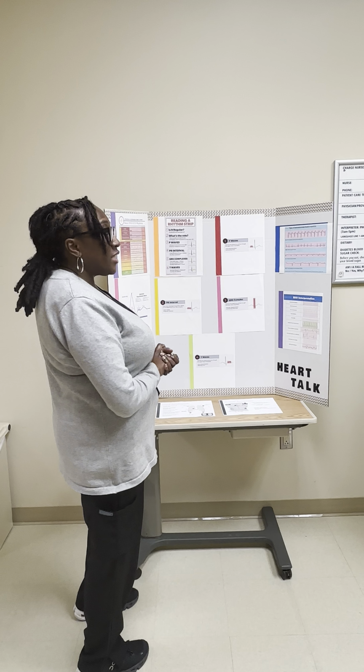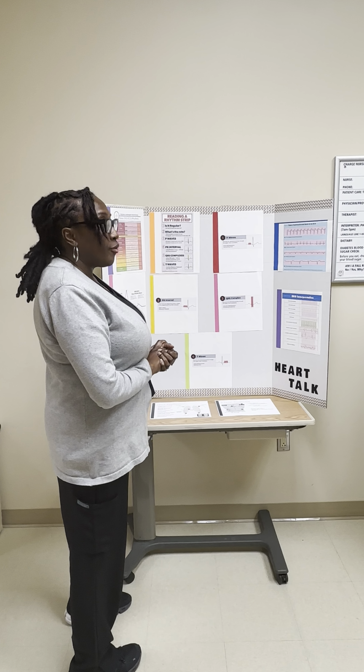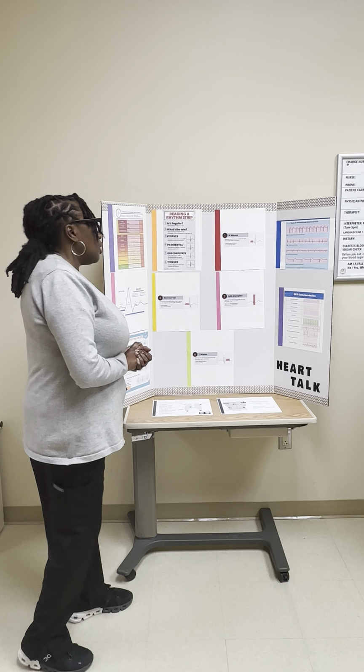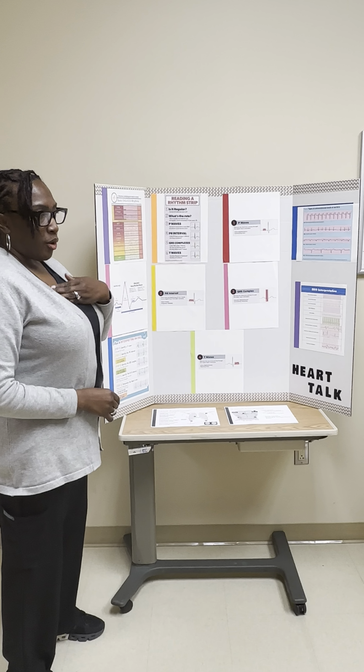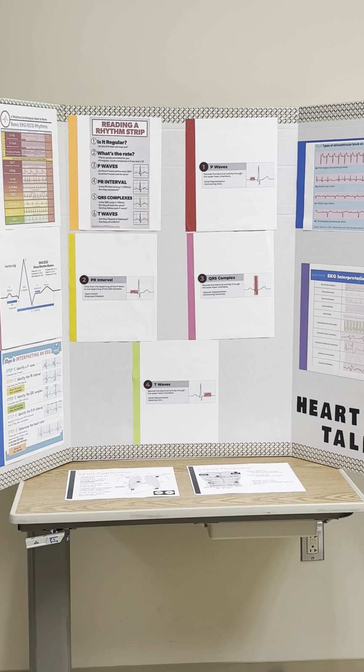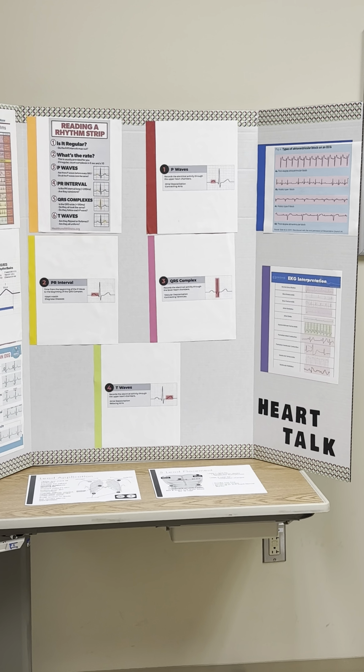And when we place those leads, we want to make sure we're going back at least every 24 hours and assessing that skin. Again, some of these people have reactions to the adhesive. We all see those burn marks and everything, so we just want to make sure we're rotating those sites so we have good solid connectivity on those.